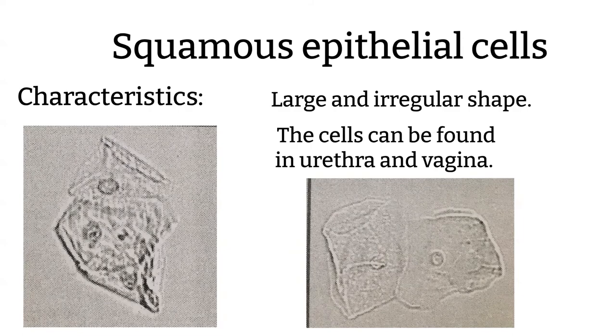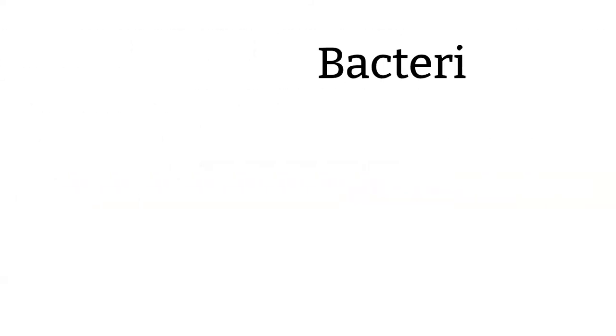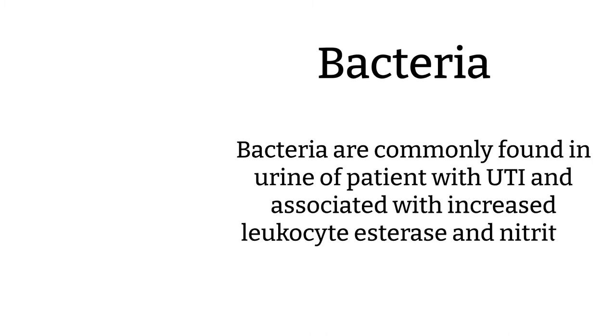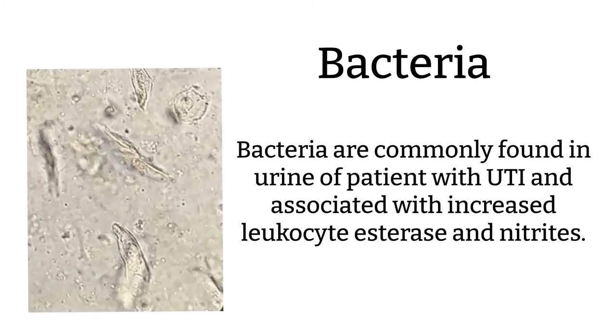Bacteria. The presence of bacteria is a common finding in urine. However, increased amounts are consistent with UTI. Nonetheless, the presence of bacteria alone cannot determine that the patient has UTI. The presence of bacteria with a negative leukocyte esterase and a negative nitrite suggests that the high number of bacteria is due to poor collection technique.